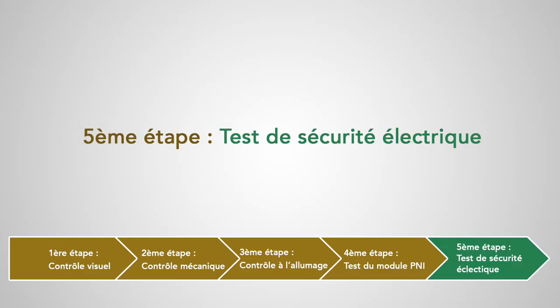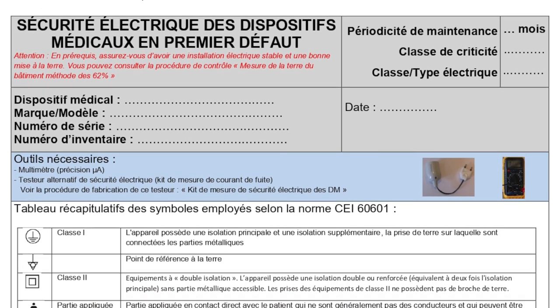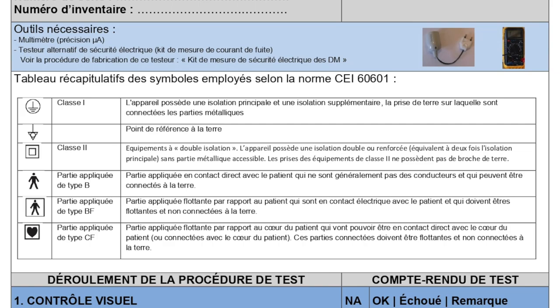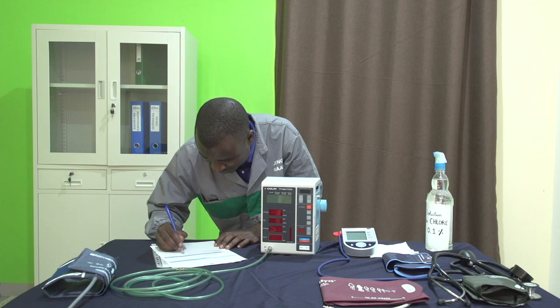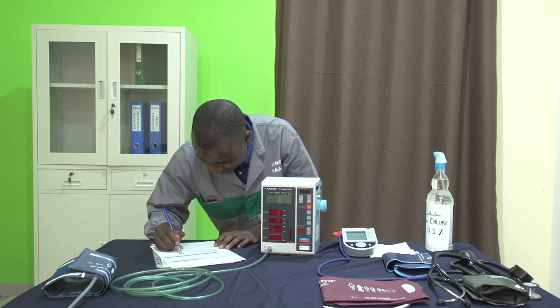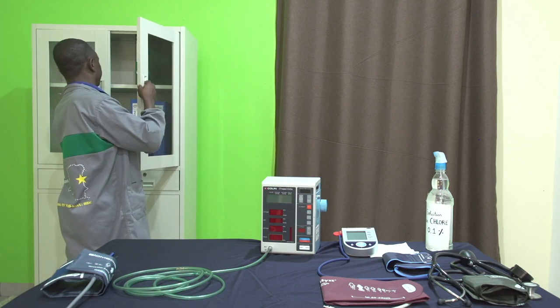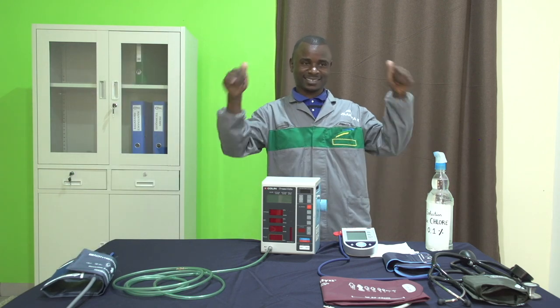Cinquième et dernière étape : test de sécurité électrique. Pour cela, nous vous renvoyons vers la procédure de sécurité électrique que vous trouverez en lien sous la vidéo. Une fois que nous avons vérifié notre appareil en suivant toutes ces étapes, n'oublions pas de compléter et d'archiver le compte-rendu et d'enregistrer les résultats dans nos outils de suivi. L'appareil ne peut être rendu au service utilisateur que si toutes les étapes sont validées. Sinon, des réparations ou des achats d'accessoires de remplacement seront à prévoir. À vous de jouer !